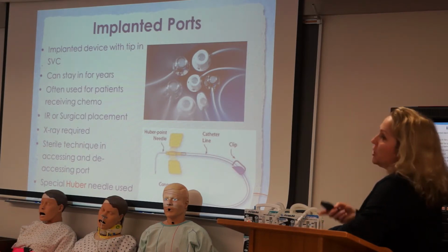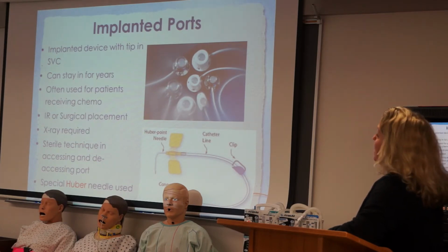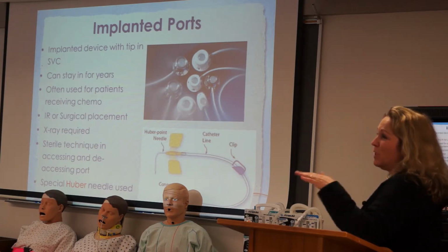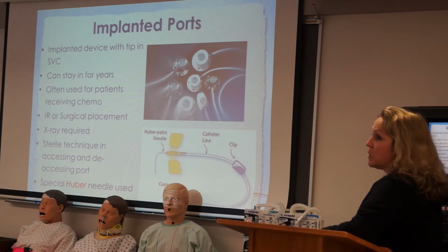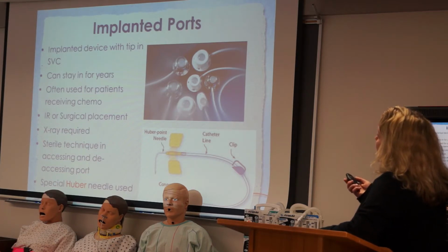But the ports for sure, and your other regular central lines except for PICCs, really do need to be heparinized regularly, especially when they're not being used, because you don't want any kind of clotting or buildup of fibrin in the line to prevent them from being used. You don't want to ruin a port or a central line, have to have it taken out and put a whole new one in again. So you want to make sure that it's able to be flushed appropriately and you can draw back on it. So you will see these. There's different types. Like I said, they're mostly used for patients who are going through chemo.